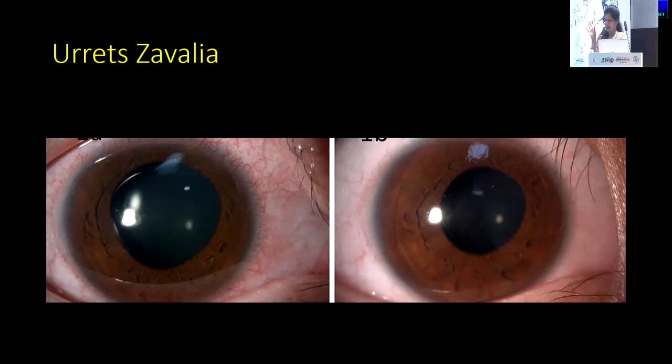and looking like that. So now this I thought was a routine post-operative elevation of IOP, which is very, very rare, but I thought some visco might have got trapped somewhere. But even after the intraocular pressure was relieved, it took a very, very long time for the pupil to come back to normal. Even at 2 months, this is how his eye looked.